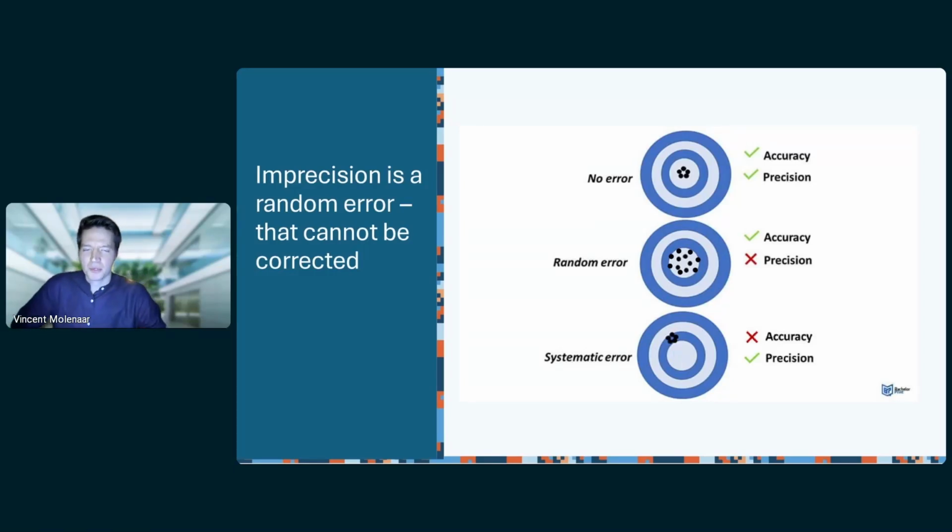The reason why I'm showing you this specific figure is because most of the laboratory professionals here probably already know and have seen this figure multiple times in different forms. And accuracy and precision are very important pillars for the lab. But when I was working in the IVD industry, we tested some of these microsampling devices also. And what we saw was exactly this imprecision problem or phenomenon. And of course, in the lab, this can occur from analyzers, and they will always have some form of imprecision. But the kind of magnitude that we found was so big that we had to look into this further.